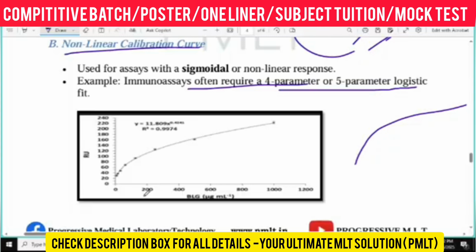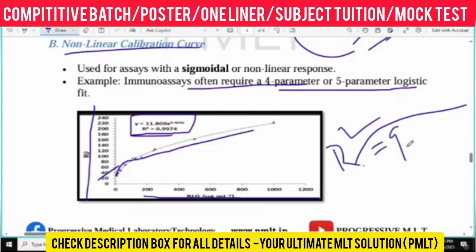That is the known concentration, and these kinds of concentrations, 0, 20, 40, 60, we are getting from the instrument, and we have to draw the curve here. Here also you can see that the R square is higher than 0.9974.